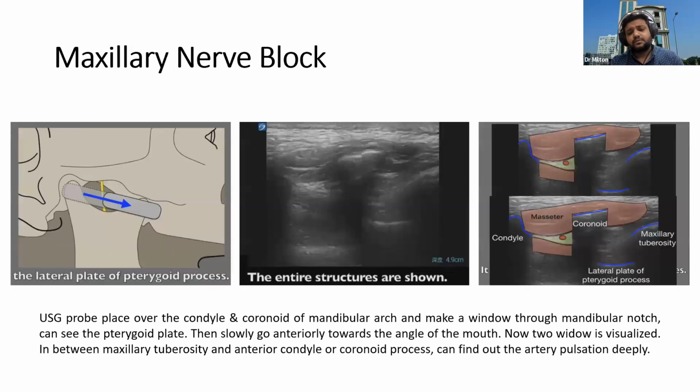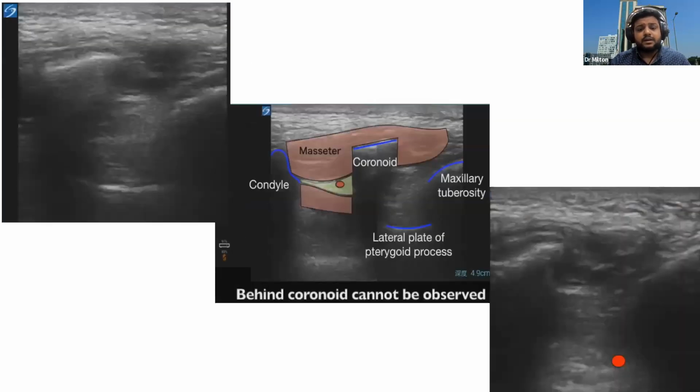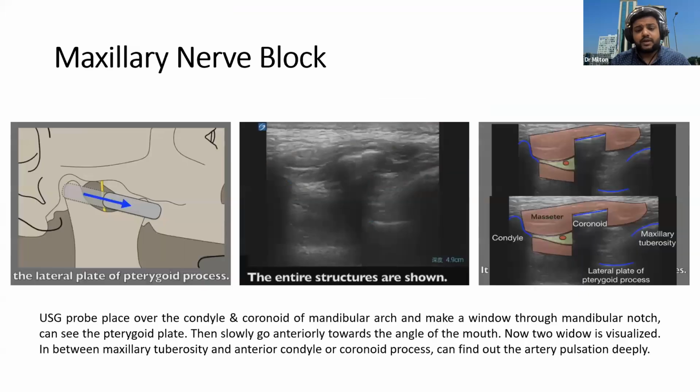Okay, so how can we identify this area? Here we put our ultrasound over this area.